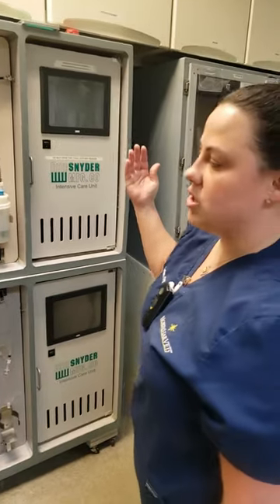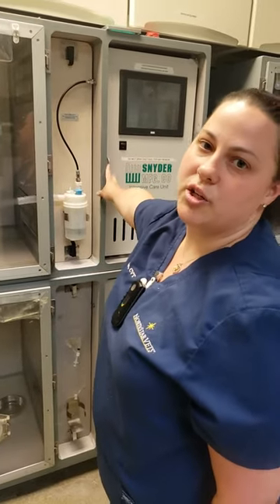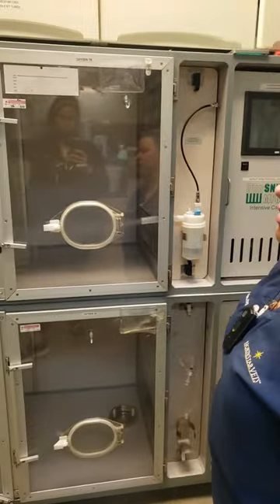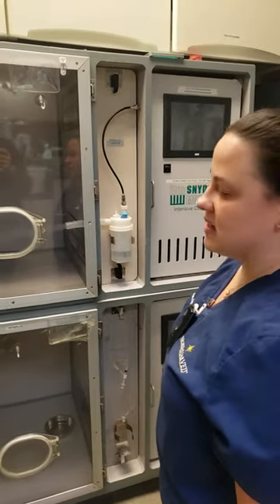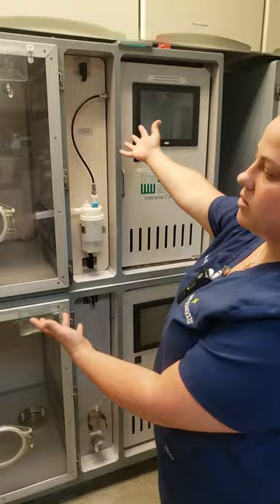Once you turn your cage on, you will have to restart your oxygen and your temperature control, but then it'll suck out all of the extra nebulizer steam in there, and then you're ready to go. But that's how you do your nebulizing.